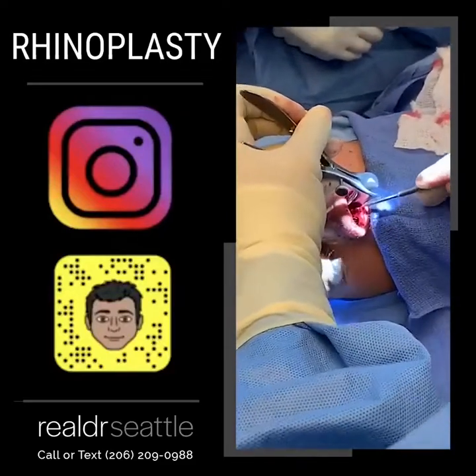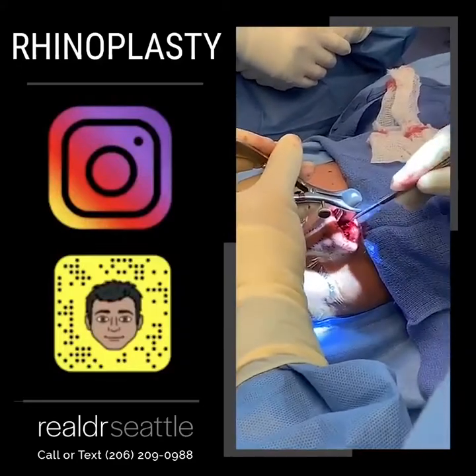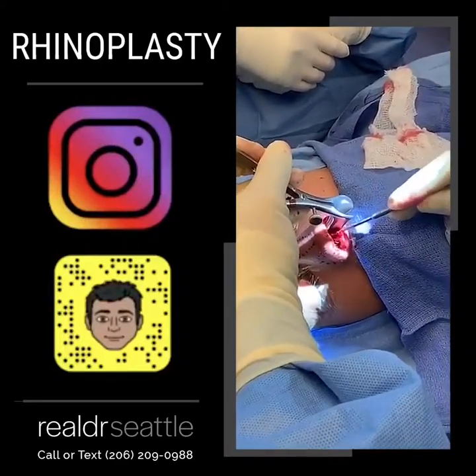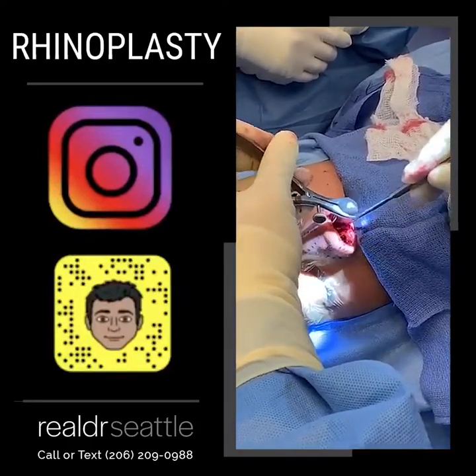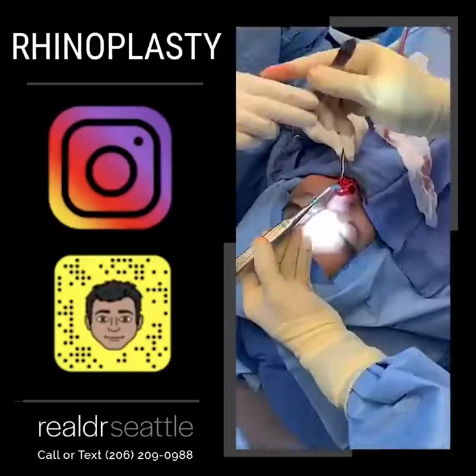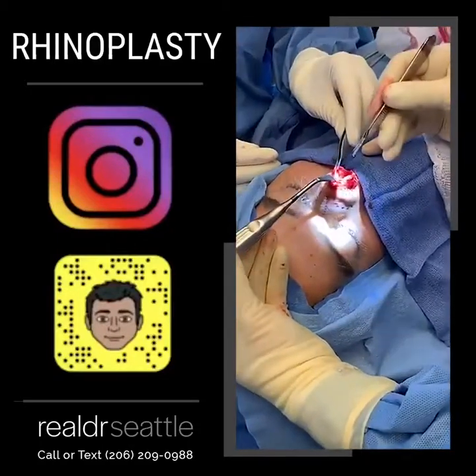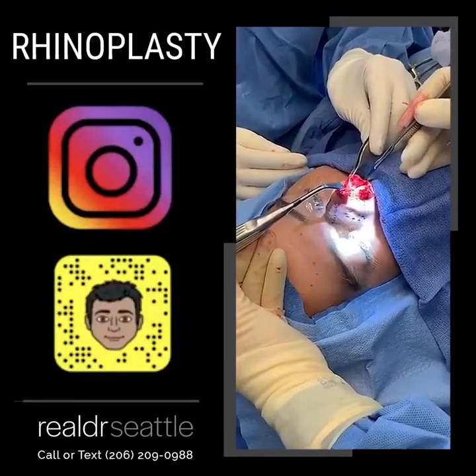This is a very technically challenging part. Right now I'm getting to what's called the osteocartilaginous border — where the cartilage of the septum becomes bone. And we're going to separate the upper lateral cartilage from the septum.